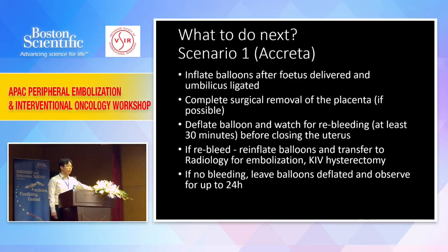before the obstetrician closes up the uterus. If it rebleeds, you can always reinflate the balloon and then transfer the patient to radiology for embolization. If that fails, then the patient undergoes a hysterectomy. And if there's no bleeding, you can leave the balloon deflated and observe for up to 24 hours. Some people do that and some people don't.